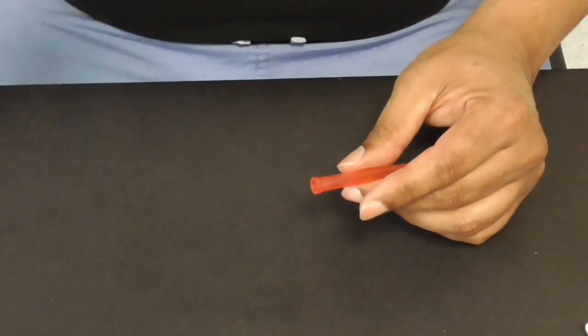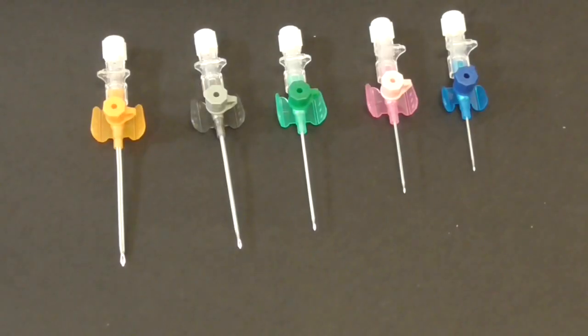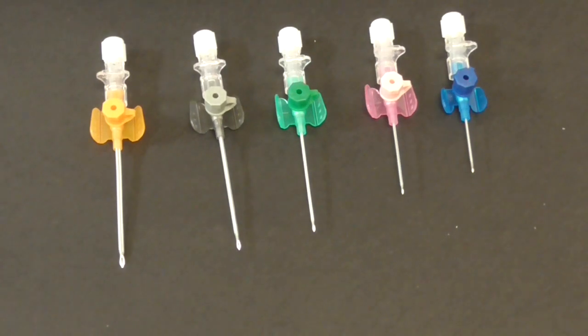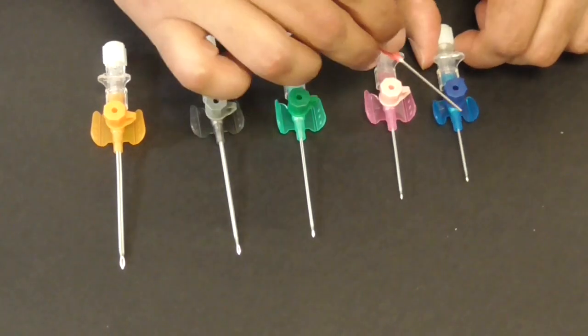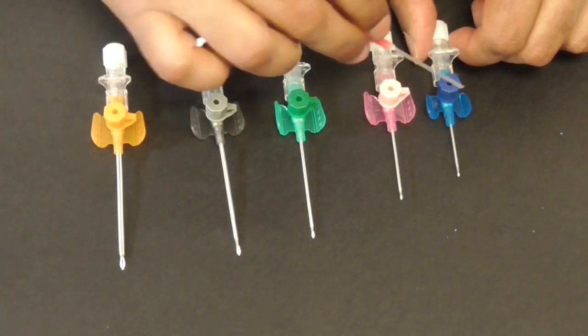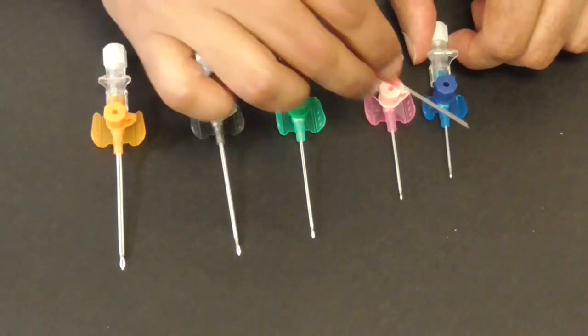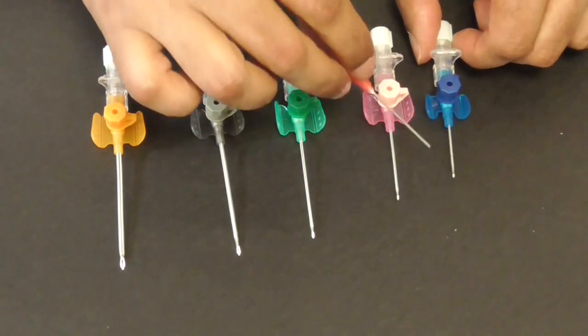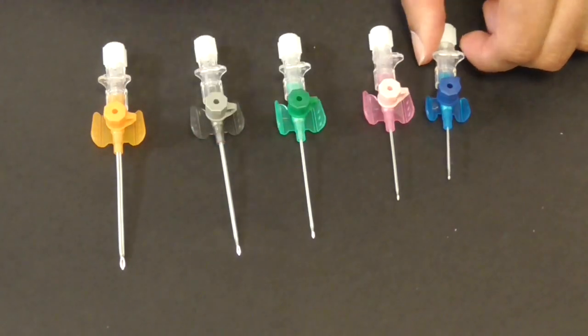So now we're going to talk about intravenous cannulae or venflons as is commonly known after a trade name in the United Kingdom. You can see that the intravenous cannulae all have different colors. These are again color coded much like the needles and each color designates a particular caliber of the needle. You can see the needles have different lengths and the smaller the caliber the smaller the length of the needle but that's not the point.